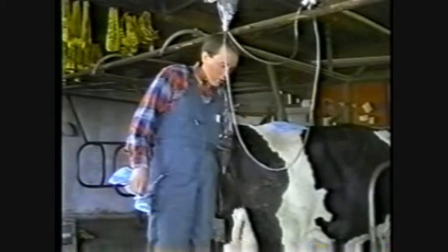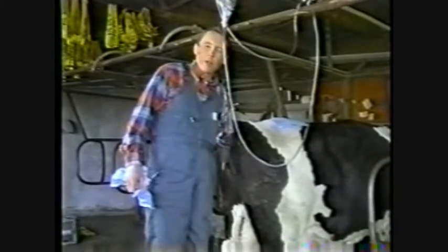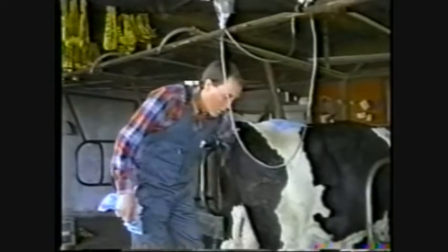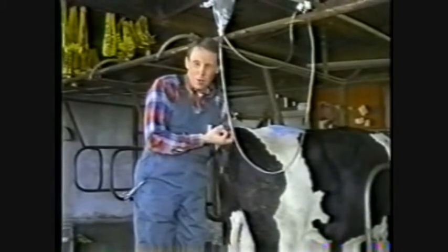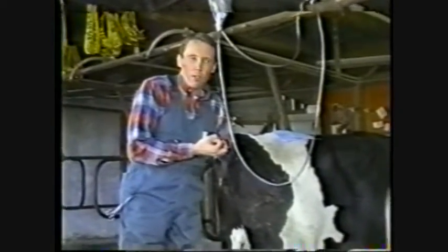Right ovary. 2 or 3 CLs. 1 or 2 follicles, small points that did not ovulate. On the right and the left is... The left ovary is about that large, very small, since it didn't do a whole heck of a lot. 1 follicle on the left.